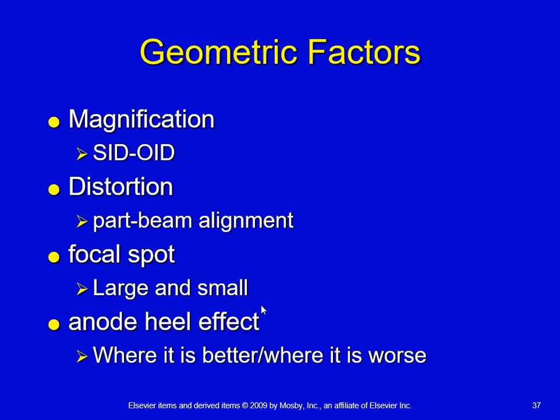Now we talk about geometric factors. Geometric factors have everything to do with lines and planes and angulations. So when we're referring to geometric factors, now we're getting into actual sharpness, recorded detail, and the size and length and sharpness of the image that we're trying to record.